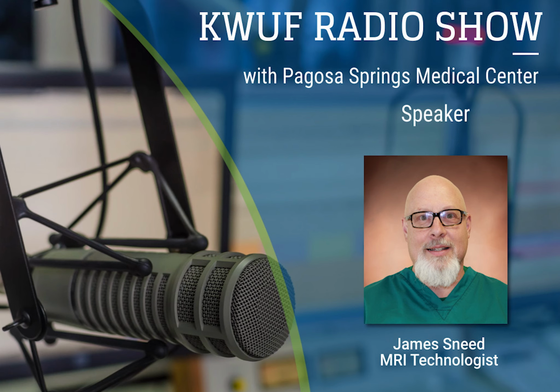Most of our scans run 30 minutes without contrast. But we do have 1 hour slots with contrast, and we have up to 2 hour slots for specialized abdominal imaging. We've also been able to add breast imaging to the magnet, and we have extended our hours. We're now running 10-hour days, and we run about 10 slots per day.